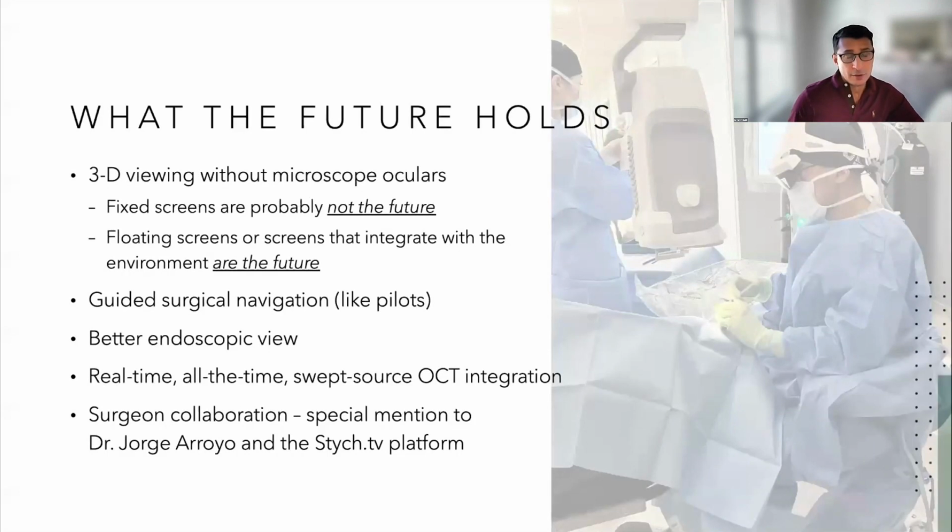Also, some other future projections. I do 3D viewing without microscope oculars. I think that as good as that is, the fixed screen, the 3D screen that I'm looking at, that's not the future. The future is going to be some type of floating screen or some type of screen that integrates with the environment, such as augmented reality or virtual reality, where you can place different information in your real space. That is a part of viewing, right? This is relevant to surgical viewing because that'll increase our viewing potential.